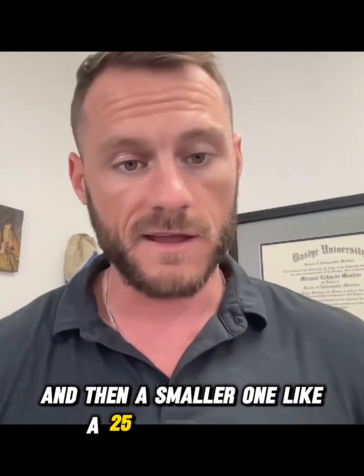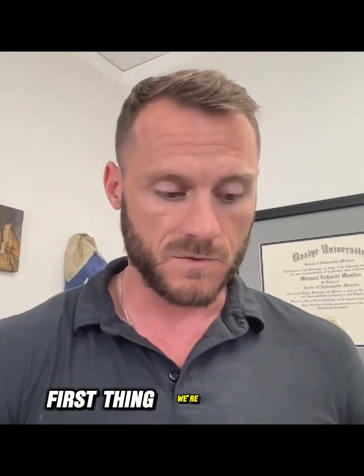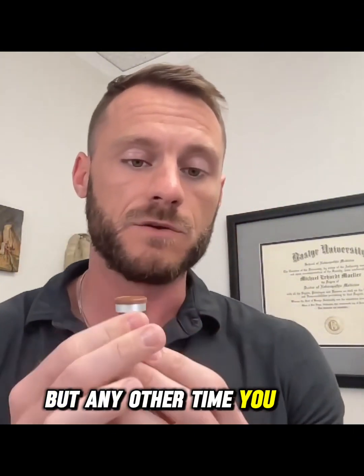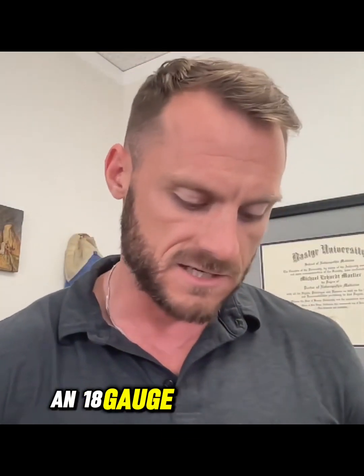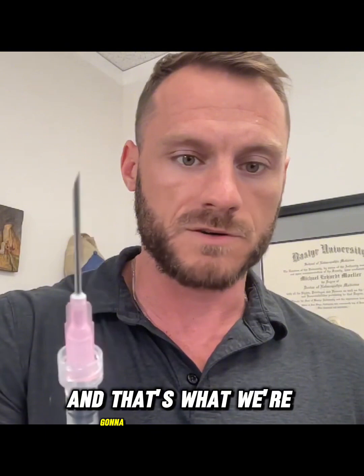First thing we're going to do: when we get these vials we can pop the top off and it's still sterile, but any other time after that you need to alcohol it off. We'll take the one ml syringe and the 18 gauge needle. Think about shotguns — an 18 gauge is going to be bigger and thicker than a 27 gauge, so you don't want to inject yourself with a needle like that. That's what we're going to draw up with.